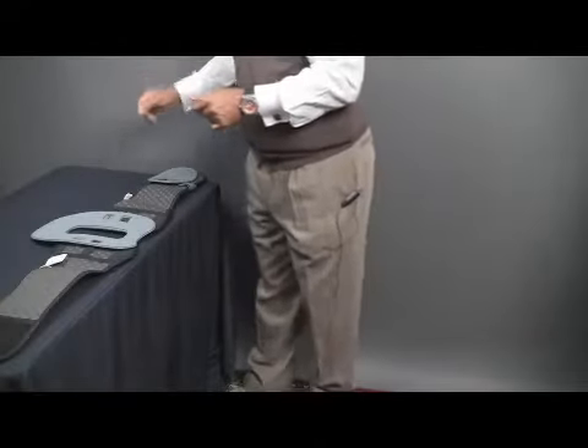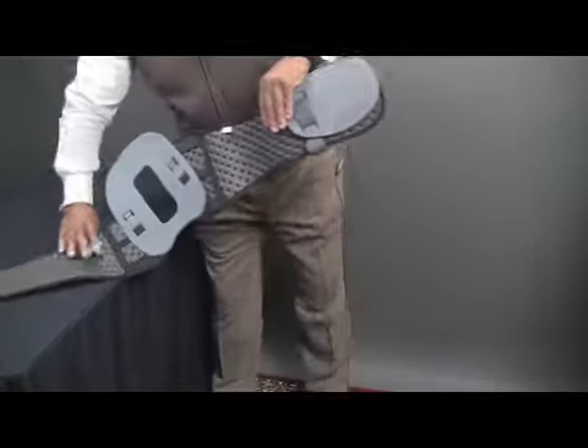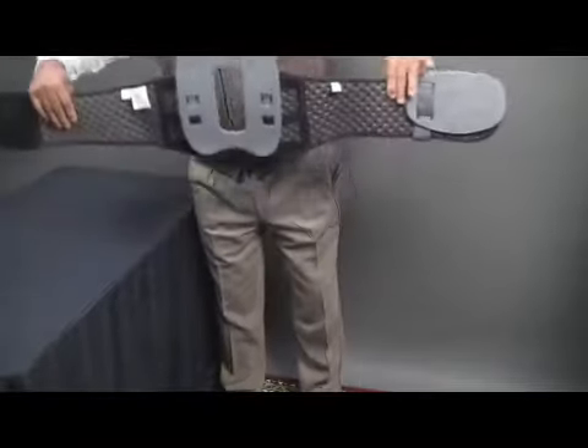Now we're ready to fit a Cybertek Premium Plus Brace. Again, waffle pattern. Again, larger posterior panel than you have in the Cybertek Flex.